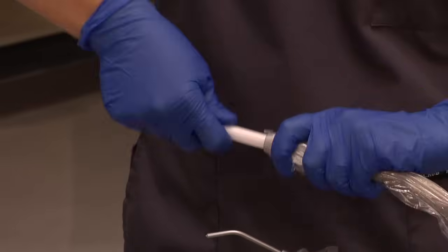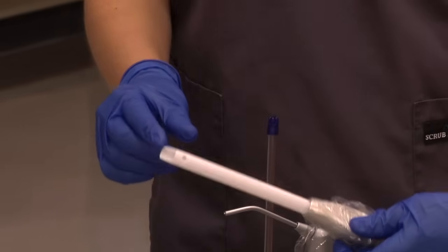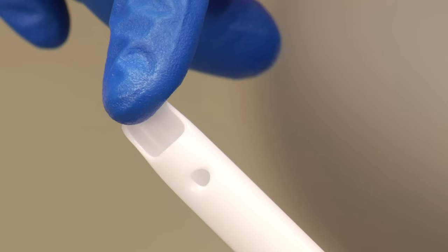The HVE tip should be placed into the hose connector with the bevel of the tip open and facing up and in line with the suction device finger switch. The hole or slot on the HVE should be up to go into the patient's mouth.